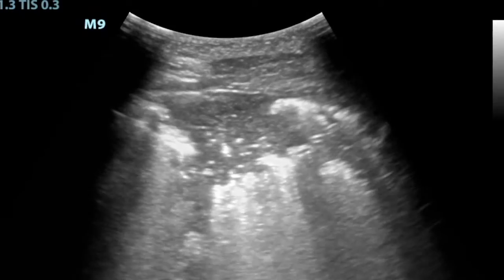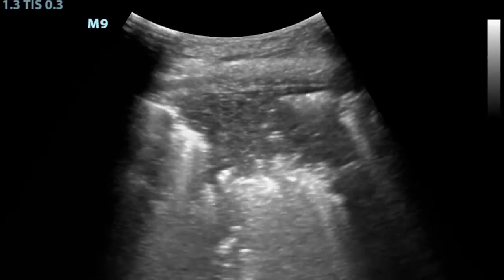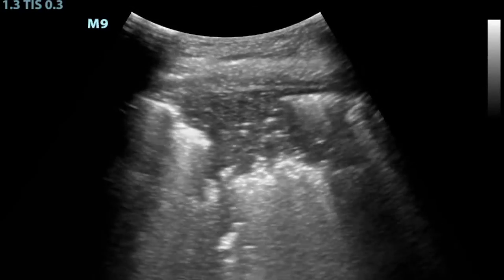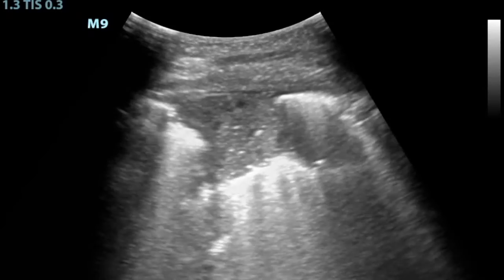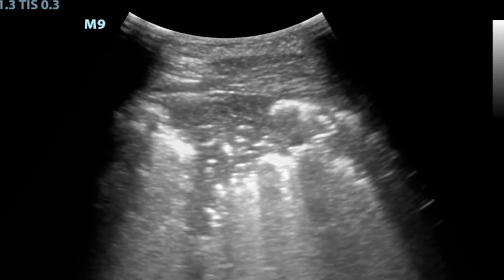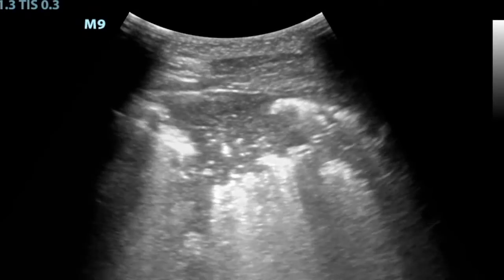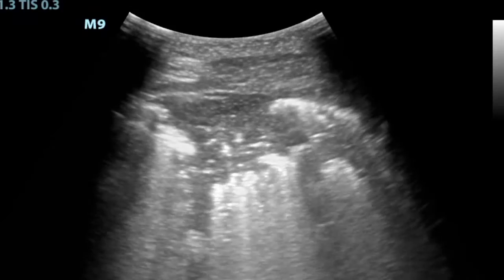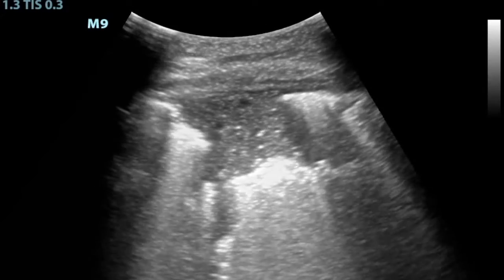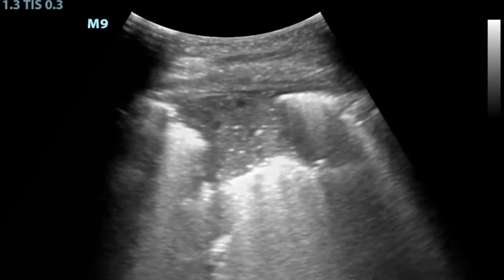To review: we see dynamic air bronchograms in consolidations, aka fluid-filled alveoli, and we see static air bronchograms in atelectasis. Keep in mind that you can only see the periphery of the lung with ultrasound, but this is generally where we'll see pathology first.